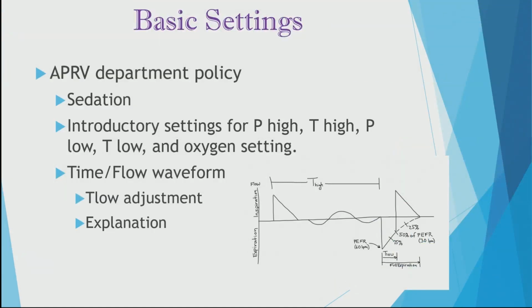Now, let's move on to some basic settings. There are multiple ways in which you might apply APRV to a patient. So, with the help of one of our local physicians and some of the therapists on a council who are also seeking to standardize a way in which we apply it, I will give you a set of basic settings that can be applied to a patient.